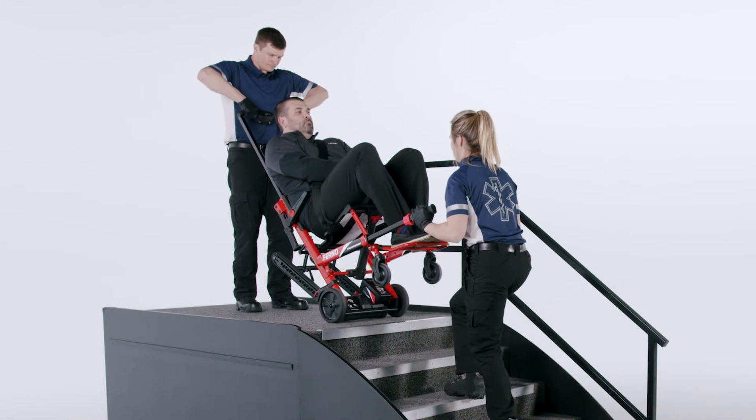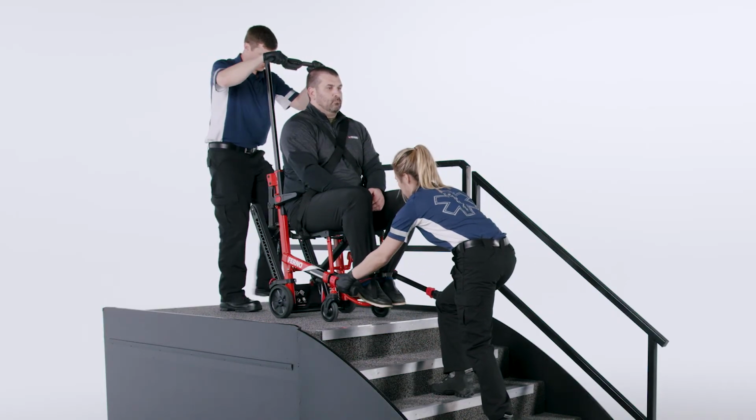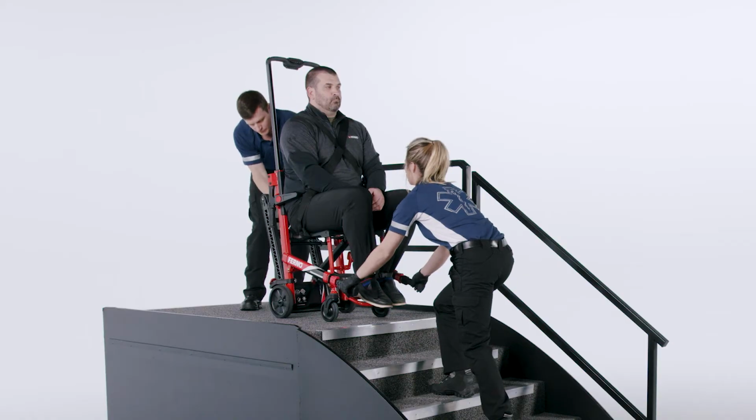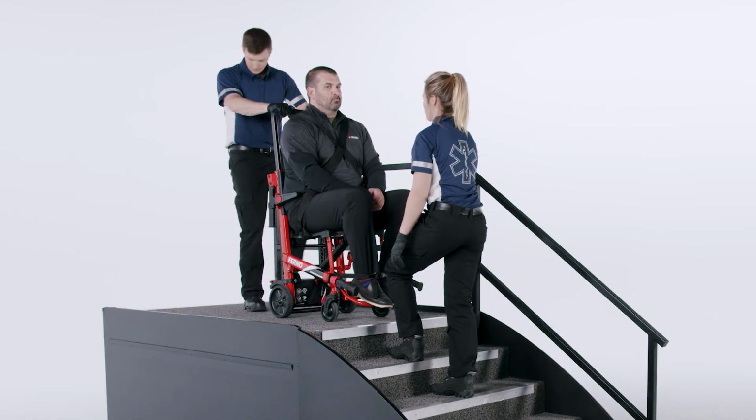At the top of the stairs, tilt the chair onto all 4 wheels as the operator stops pressing the ascend button. Retract the lift handles, adjust the lift bar, and close the track system.